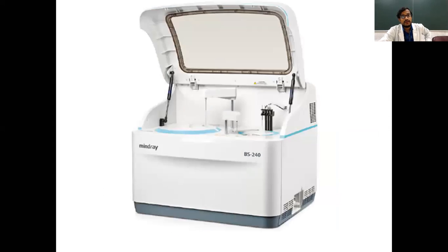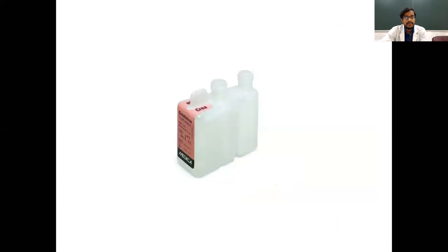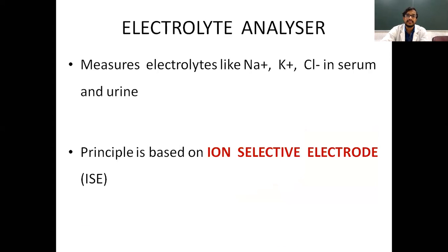And these are fully auto analyzers. All the steps are done by the fully auto analyzer. A fully auto analyzer is always connected with a monitor. The reagents and cuvettes are placed, and the reaction cuvettes are also placed. Here you can see the reaction cuvettes.